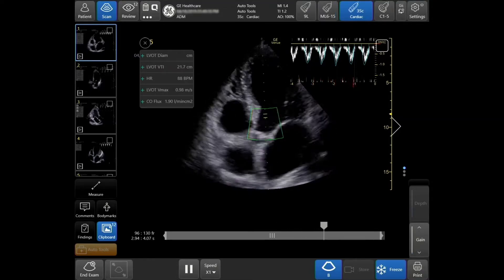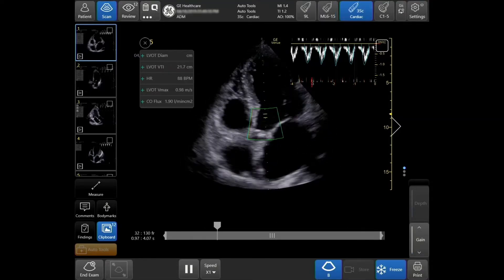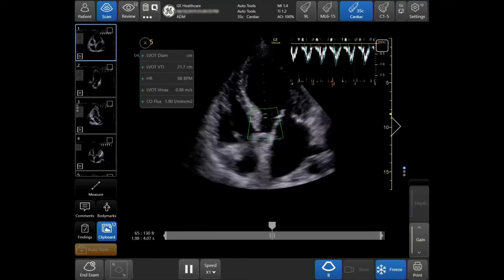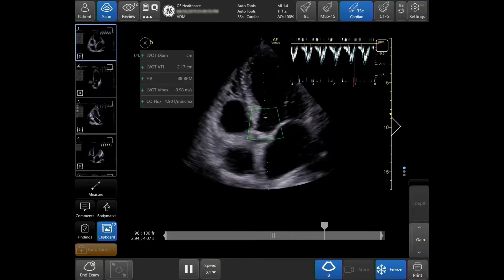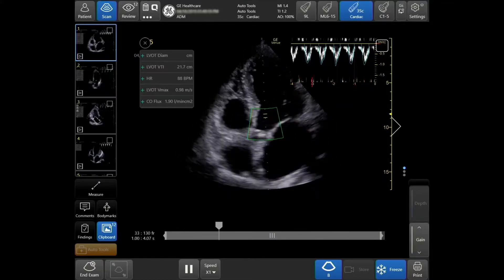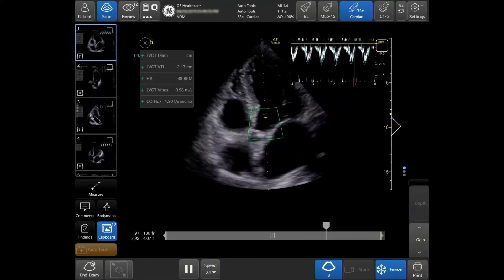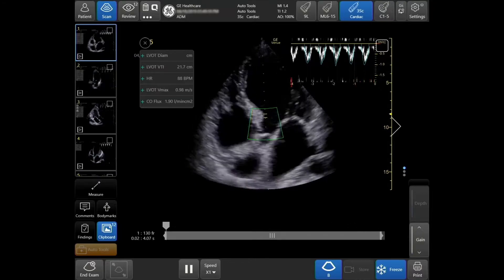Using B-mode imaging, demonstrate the LVOT by performing either a 3 or a 5-chamber apical view. Here, we are demonstrating a 5-chamber view.